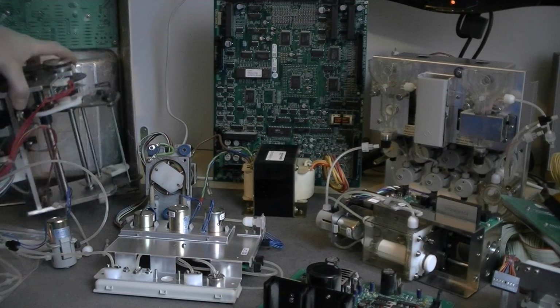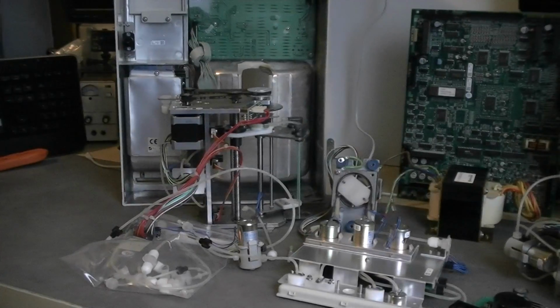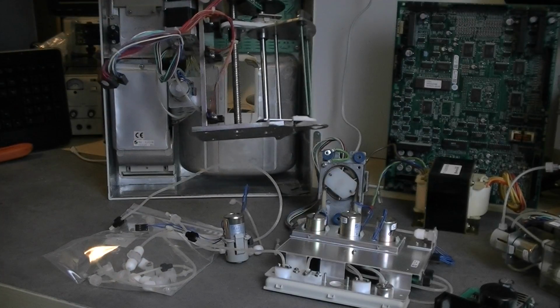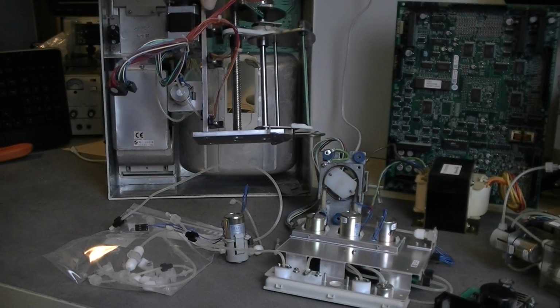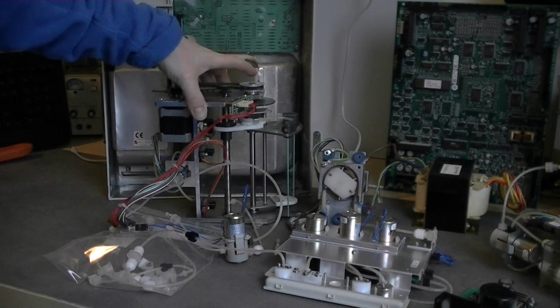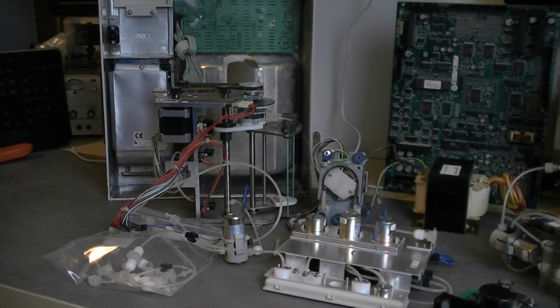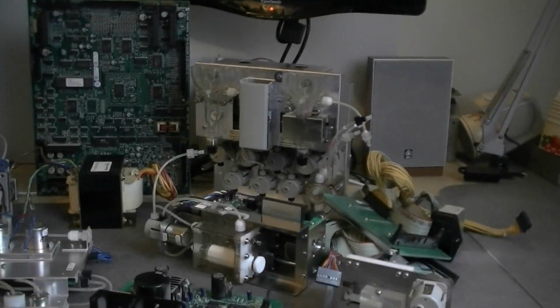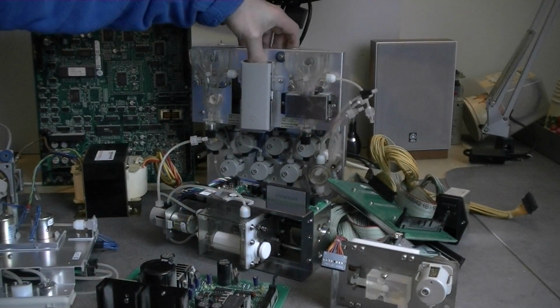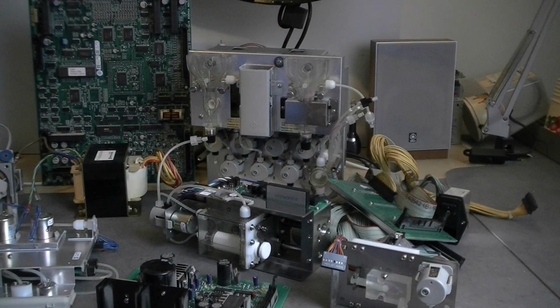And also the mechanical parts have some weight because, you can see the very serious metal construction of this one, for example. Really thick metal work. Big motors also. But apart from that, all the business here with all the sensors is maybe 1 kilo or two, something like this. Really not much.